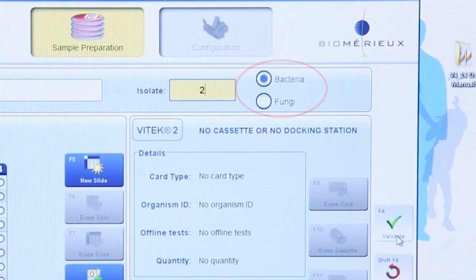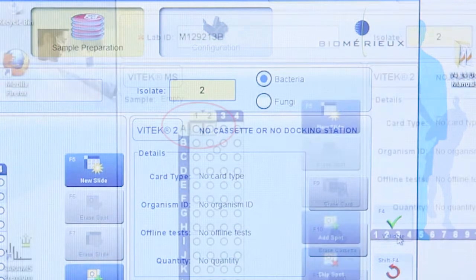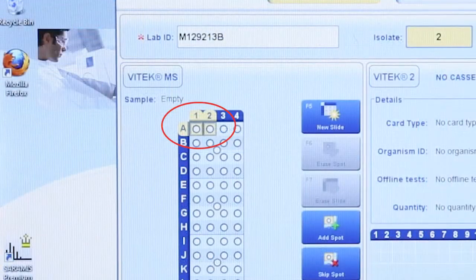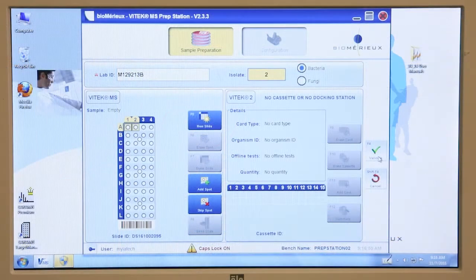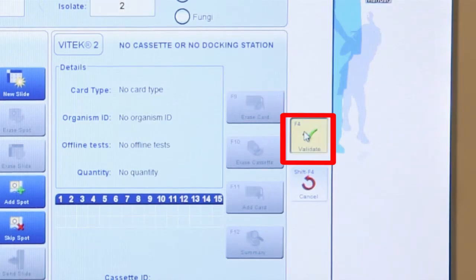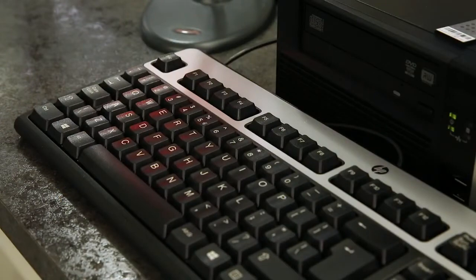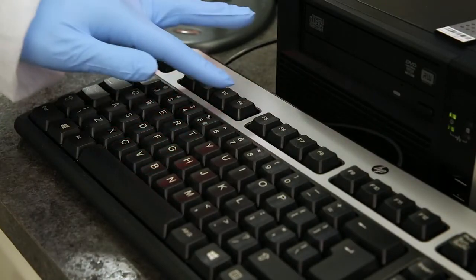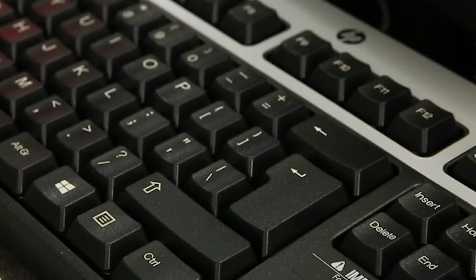Depending on your PrepStation software deposit mode configuration — single or duplicate — one or two spots will be highlighted for linking to the specimen information. Once all the data is entered, the information must either be validated or cancelled. Click the Validate button on the far right side of the screen to accept the information. Alternately, press the F4 key or the Enter key twice to validate the isolate.